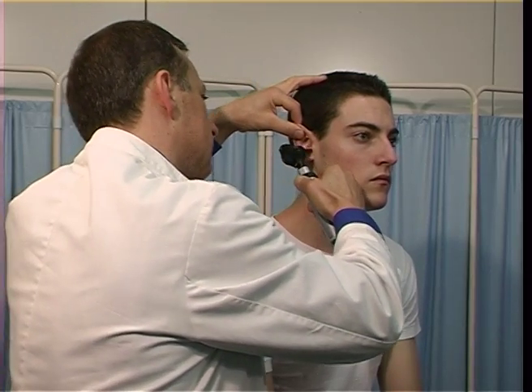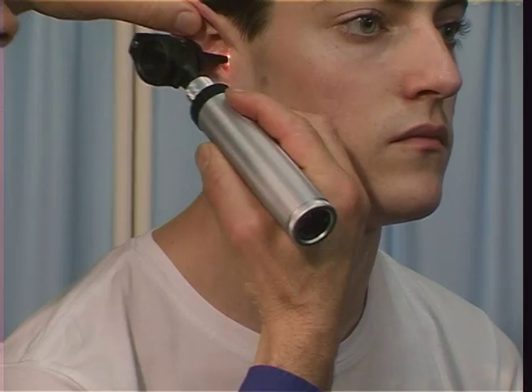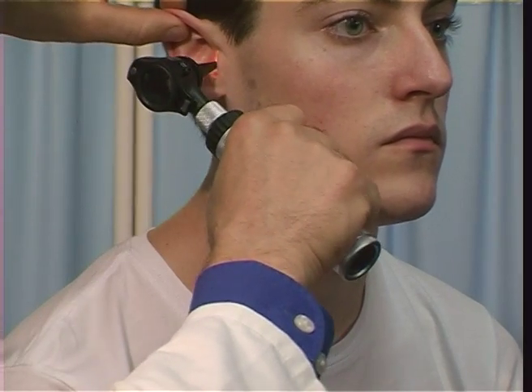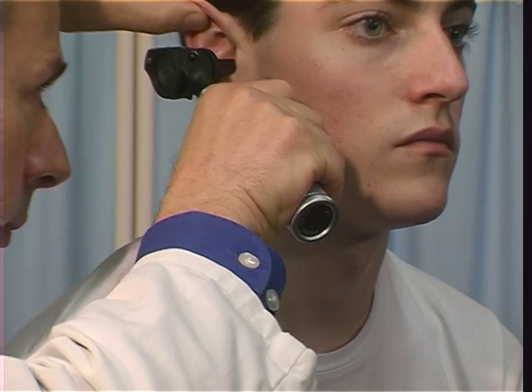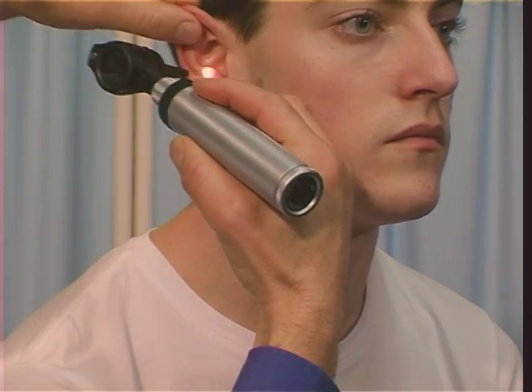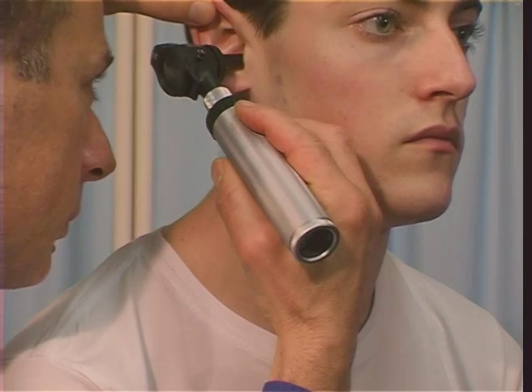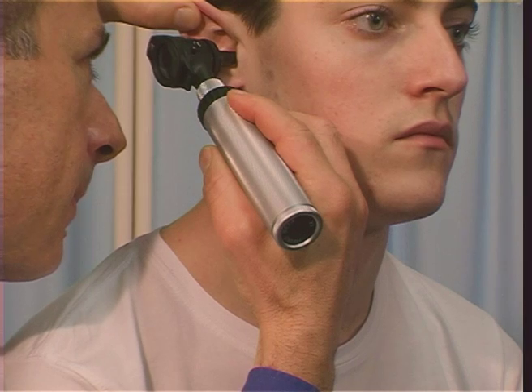If you are examining the right ear, hold the otoscope with your right hand, and conversely the opposite for the other ear. There are two methods of holding the otoscope: the hammer grip and the pencil grip. Students initially tend to prefer the hammer grip as it feels more natural, but this has its disadvantages — you will have less control and may exert unnecessary force on the skin of the ear canal, causing pain to the patient. For these reasons, the pencil grip may be considered safer for the trainee. Holding the otoscope nearer to the earpiece rather than at the end of the handle limits movement translated to the speculum and is therefore preferable for the trainee.